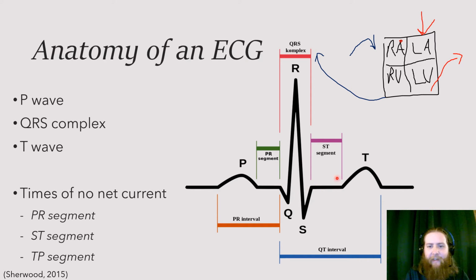There's this ST segment, where once again, the ventricles, after squishing, are now fully depolarized. So they are done there. They've squished all that they can. And then they start to repolarize here. But in between here, there's no electrical activity. They're all the way depolarized. There's no difference in electrical activity.